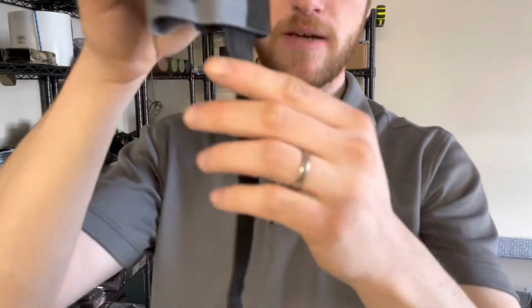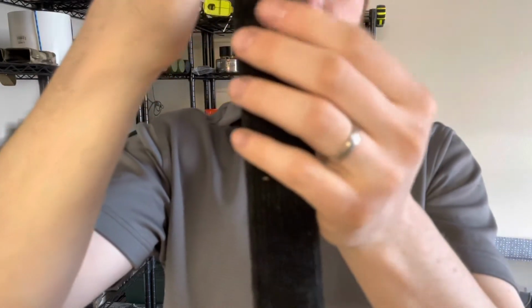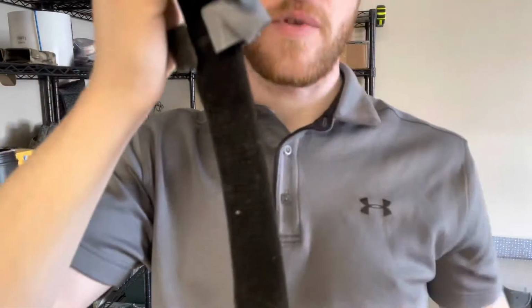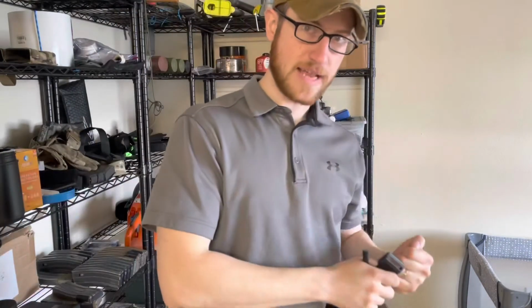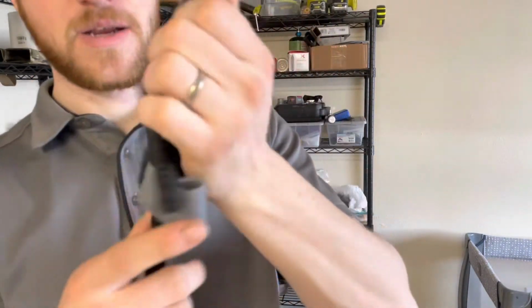You have your outer band, which is this piece right here. You have the dual Velcro here and then a nylon back. And then inside of this belt runs your inner band. This outer band will give you your initial tightening when you tighten the tourniquet down. And then the inner band, through action of spinning the windlass, will give you your full occlusion of the artery.